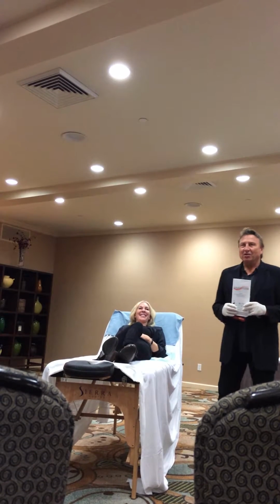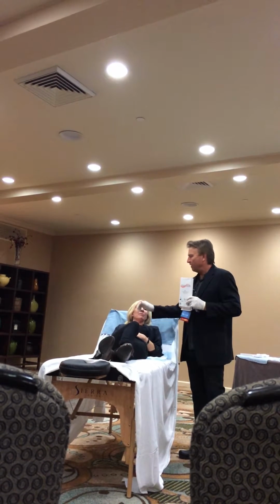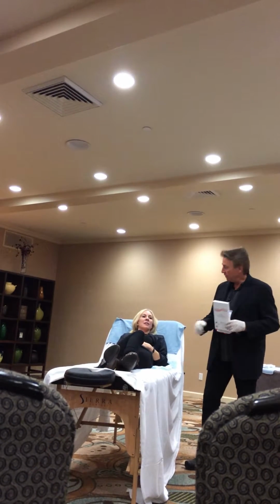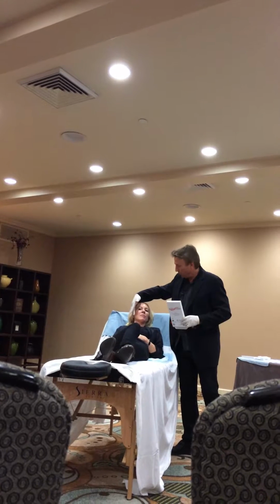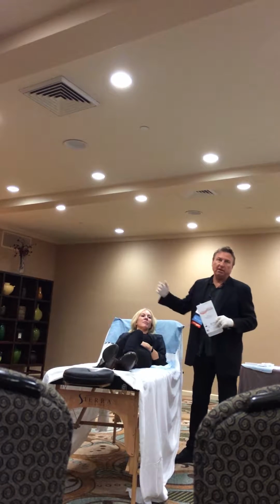Right? Anyway, so today we're going to do the X-Lift. The X-Lift means I'm going to take Expression and fill up here. A lot of us do that with other products right now. I think it's a great procedure, particularly for people in the Never Never Land between, do they need a little bit of this? Are they concerned about their nasolabial and melolabial folds? Because if we put product here, we can actually get a little lift effect. That's why I call it the X-Lift.